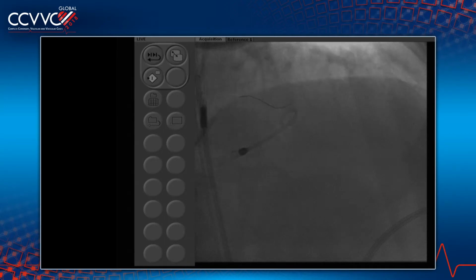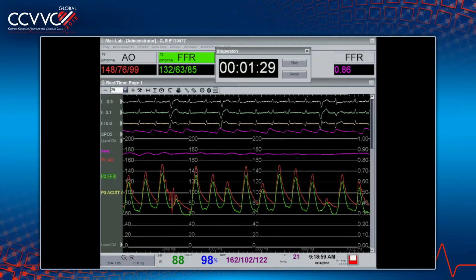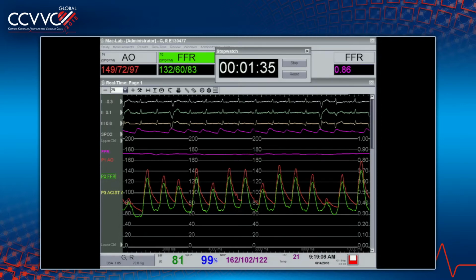This may be proximal, slightly after the left main. 0.85. This is also misleading because you've got the right that's being filled, so your overall territory is extensive, and you're planning on revascularizing the right. That may be multiple lesions. Wow. So it basically still signifies that the left main and all these cumulative lesions are significant.